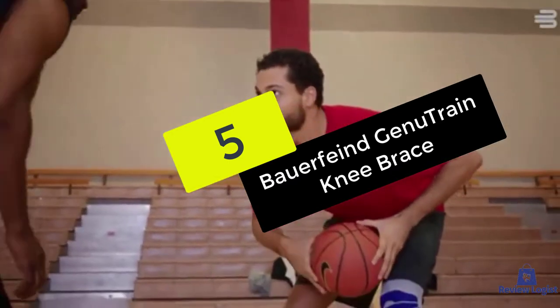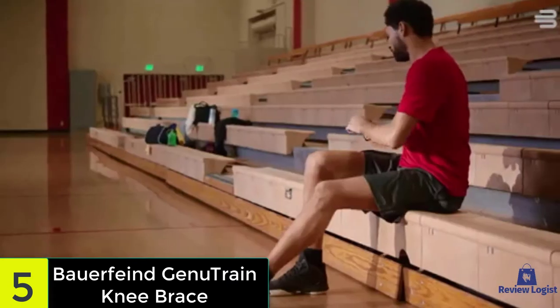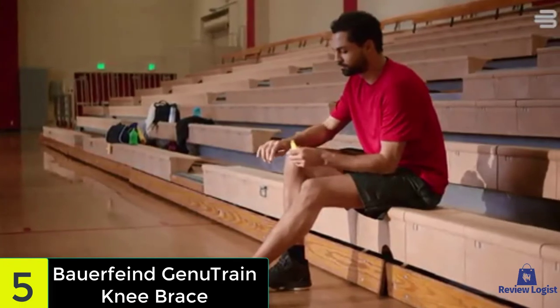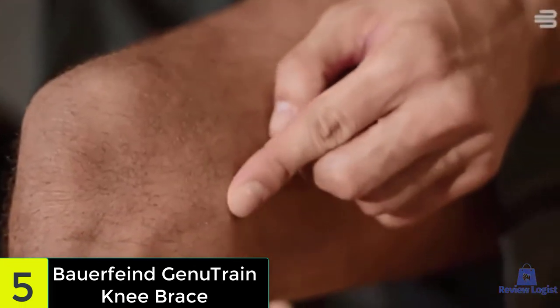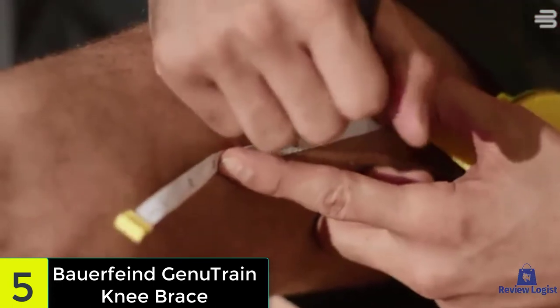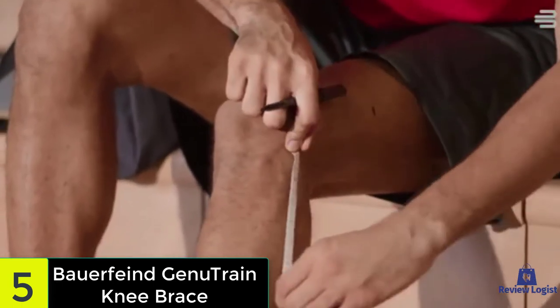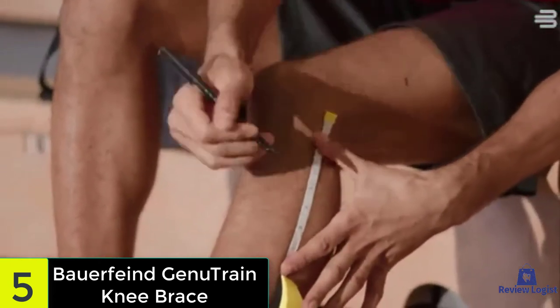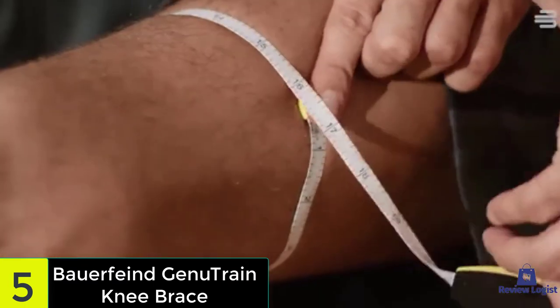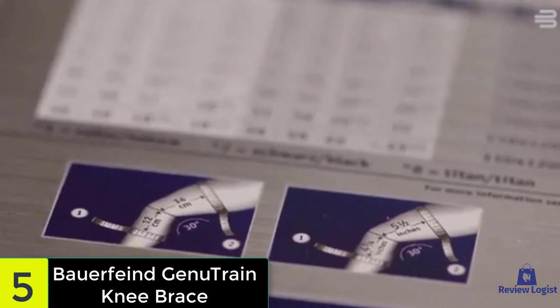Starting at number five, we have the Genutrain Knee Brace. It has been around for over three decades and in that time Bauerfeind has done a lot to improve its original knee brace design. The elastic material has many functions including flexibility, compression, and support, as well as making it one-size-fits-most. The material is breathable so there is less moisture build-up from sweat, and it's also easy to put on without causing unneeded pain. This brace also comes with specially designed edges that prevent the brace from constricting around your leg on either end.